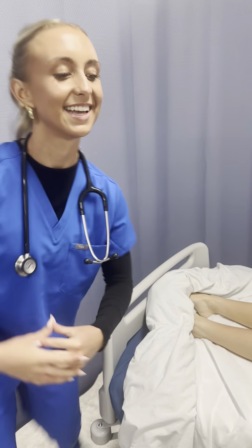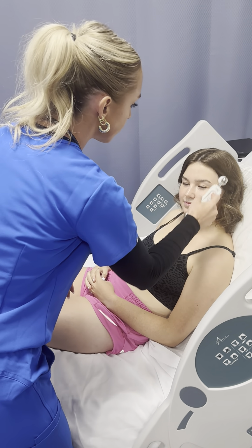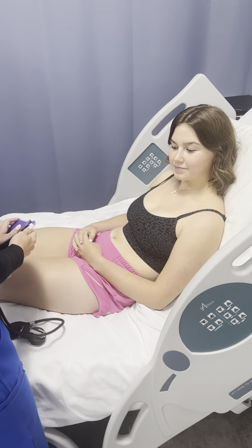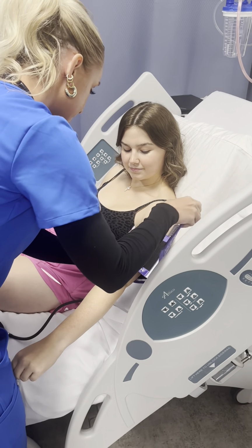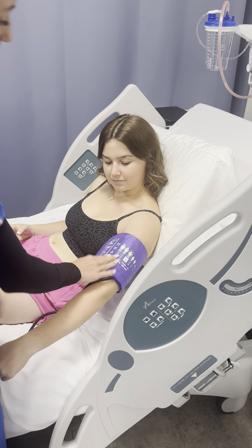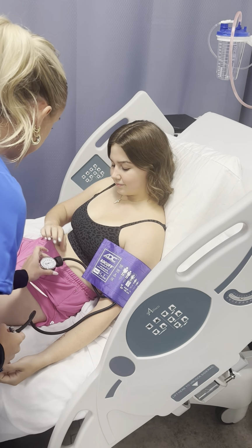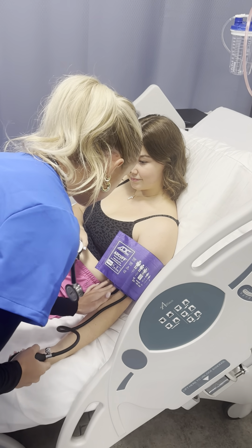Okay, perfect. Now I'm just going to take your temperature, and I'm using the temporal thermometer. Temperature is 97.6. And then now I'm just going to estimate your blood pressure, your systolic blood pressure. Thank you. Just make sure it's fitting well. And then since she is an adult, I am just going to use the adult arm size cuff, but then I would just make sure that it fits properly for her. Audrey, you'd be able to just hold this for me, please? Thank you. I'm just going to feel your brachial pulse.